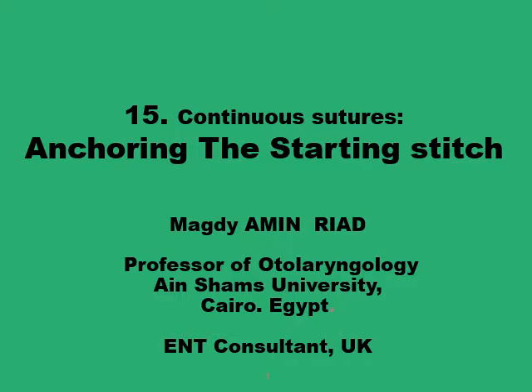Continuous sutures are useful to save time and save suture material, but perhaps more importantly, they also distribute the tension across the entire suture line when this is required. There are issues, however, with continuous sutures, in that the entire integrity of the suture line depends on two knots, one at the very beginning, the anchoring suture knot, and one at the very end, the final tie.